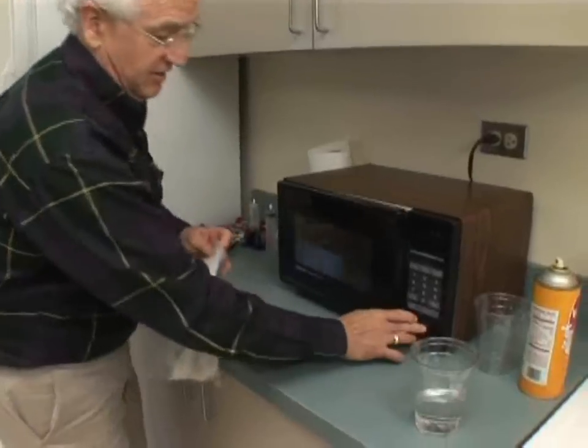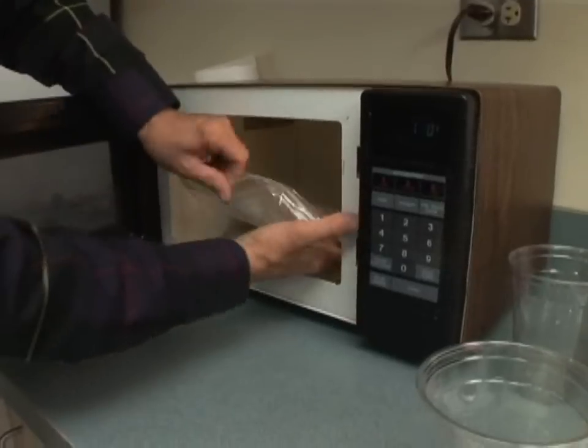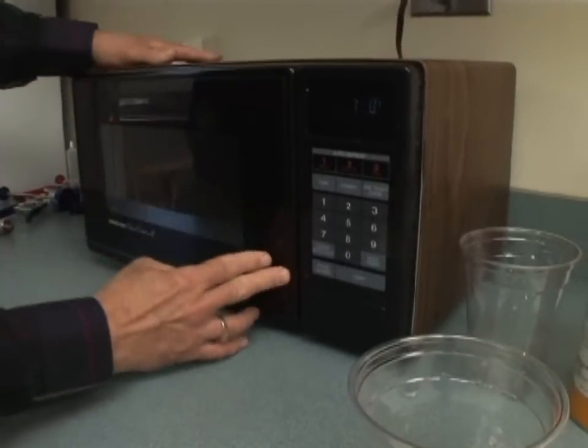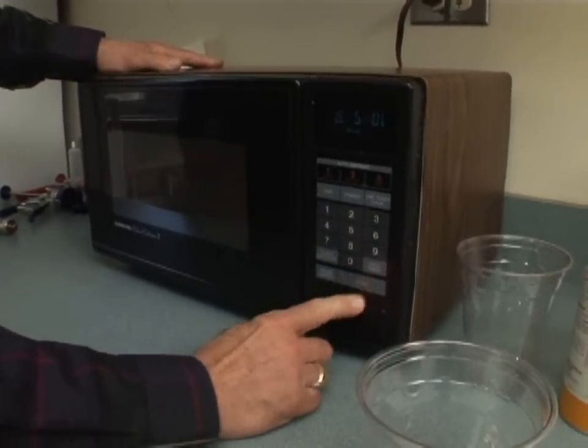I'm going to microwave it, and it's important to leave the ziplock bag open so that the steam can vent out. I'm going to set the time for five minutes and hit start.